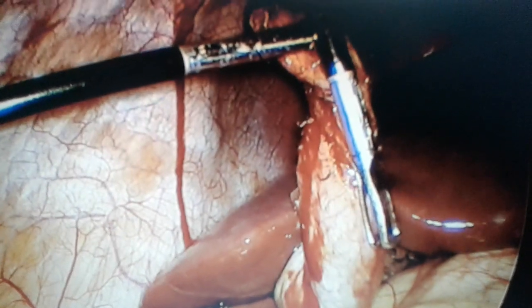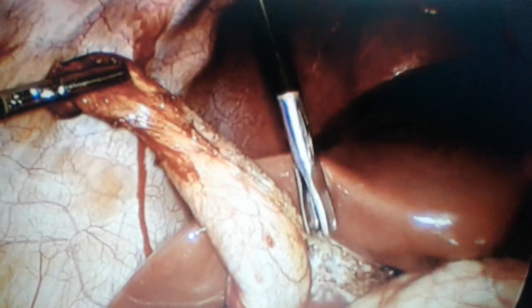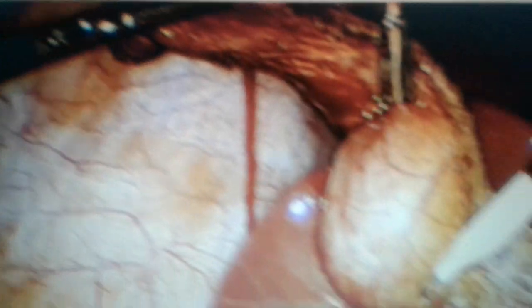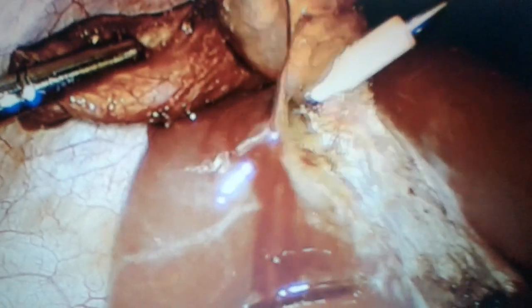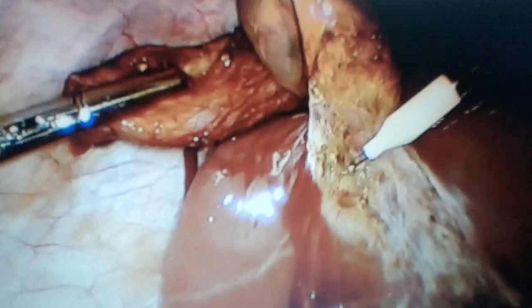So these are the common instruments, and you must learn: this is the fenestrated atraumatic grasper, and that one, the upper one, was the non-fenestrated semi-traumatic grasper. This is the electro hook. Now don't panic, just again set your position, traction, counter traction, and just continue your dissection.